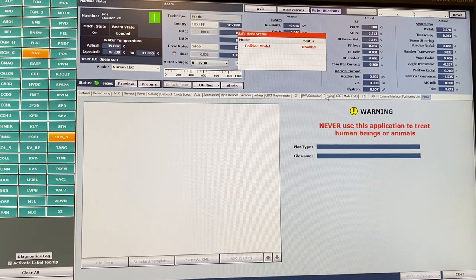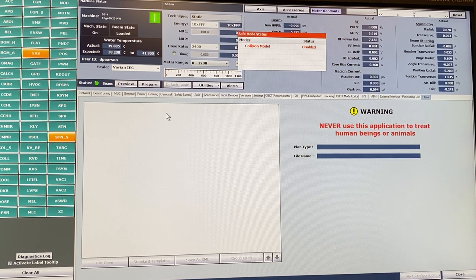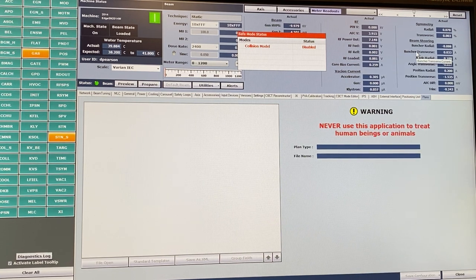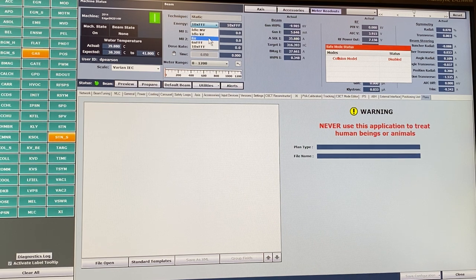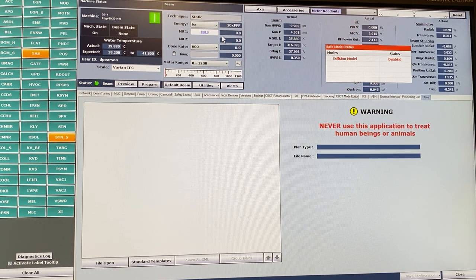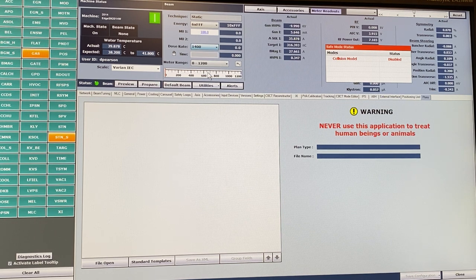From the plans tab you can load treatment plans that have been modified to run in service mode. To run a beam: in the center-left top of the screen you choose between available energies — always the ones labeled as energies rather than idle. You can type in the number of monitor units you want to deliver and change the dose rate. For 6 FFF the default dose rate can be increased to shoot at a higher dose rate.